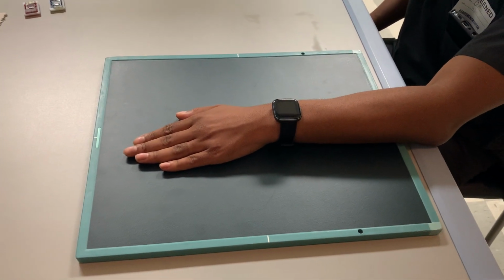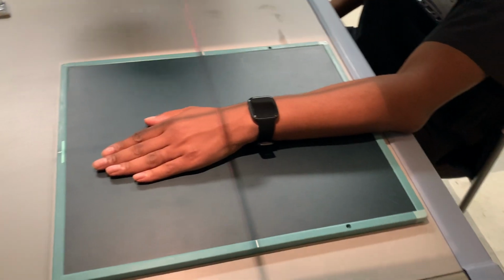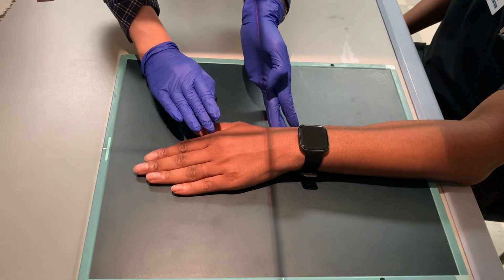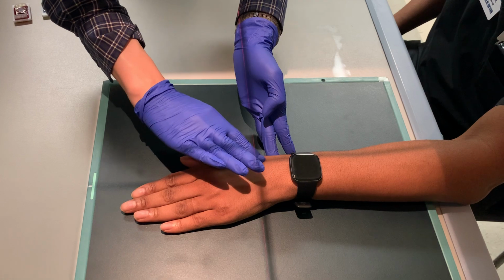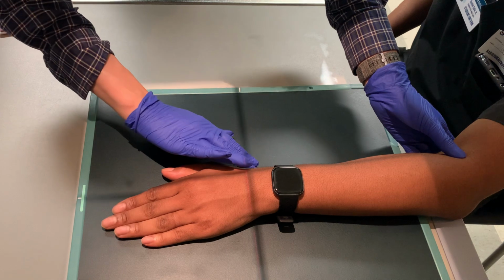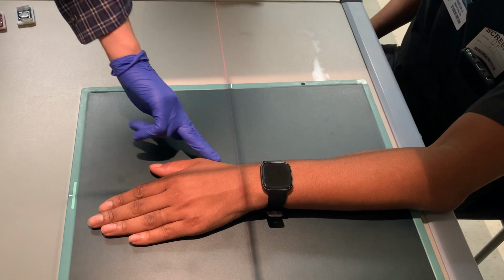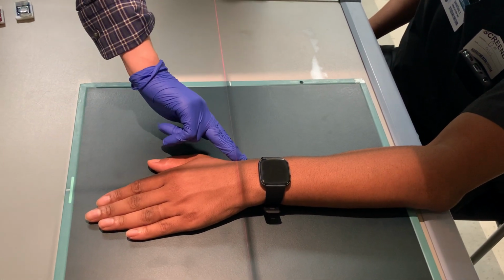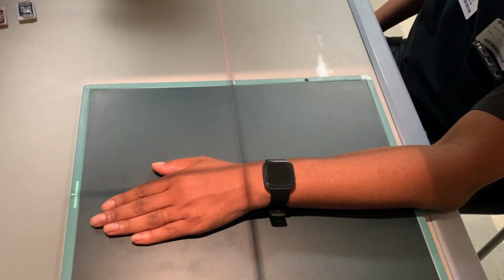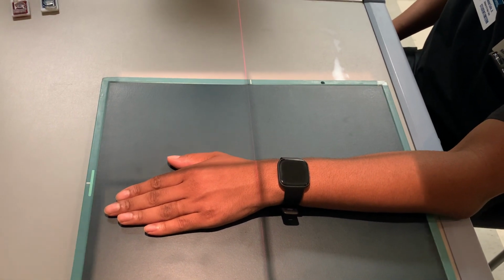Okay, that's very specific. You can try and do it like that. That is going to be absolutely textbook. I'll be very proud of you if you did. But for most purposes, you can just say, okay, so this is going to be the wrist. I'm just going to come in at a small angle this way. Okay. So right there, kind of near, more. Right, so here's that first metacarpal. I'm just going to be a little bit distal to that. But if you can do that 3/4 of an inch calculation, that would be really awesome.